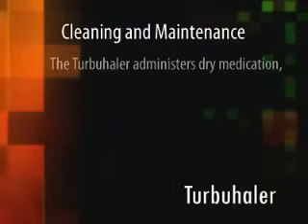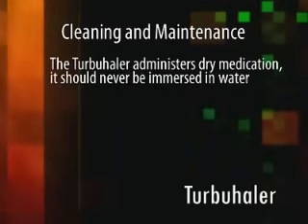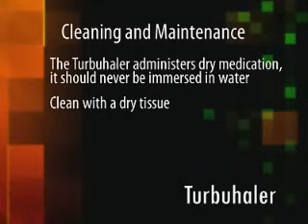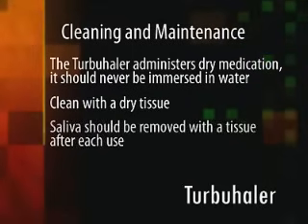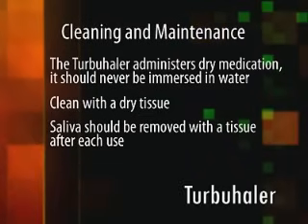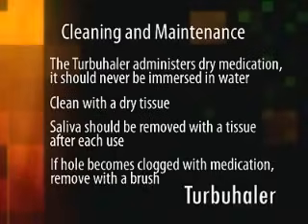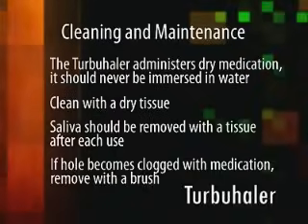Because the turbuhaler is a device that administers dry medication, it should never be immersed in water. And it should only be cleaned with a dry tissue. Saliva on the mouthpiece will also affect the device's operation and should be removed with a tissue after each use. And finally, if the hole becomes clogged with medication, it should be removed with a brush.